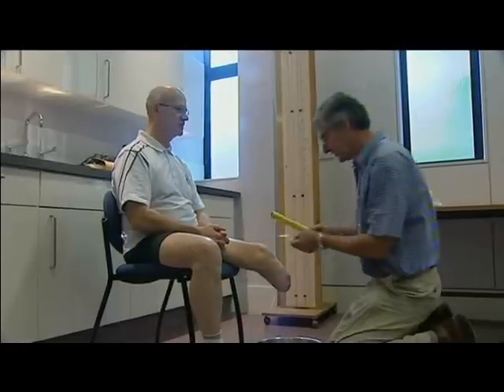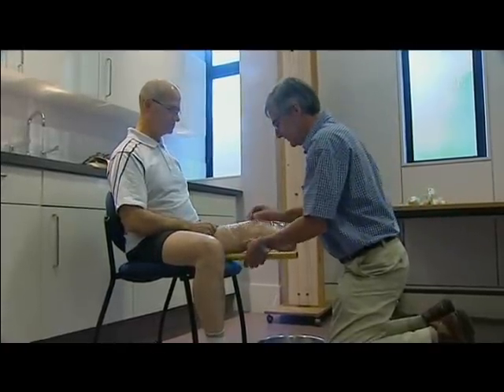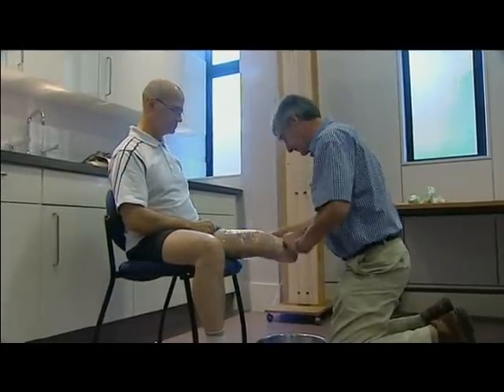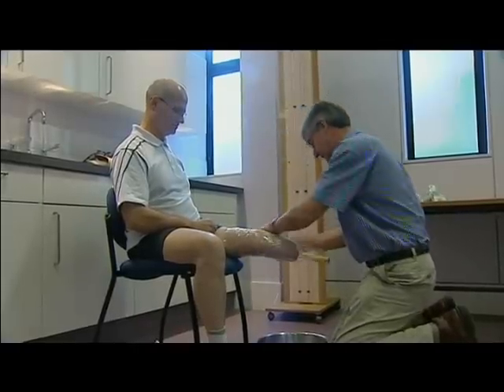Our health correspondent, Alna Bradford, reports. Wallace Currie is being fitted for a new artificial leg. He saw an advert for a bin lorry in the job centre, so he thought he'd take it on a temporary basis.